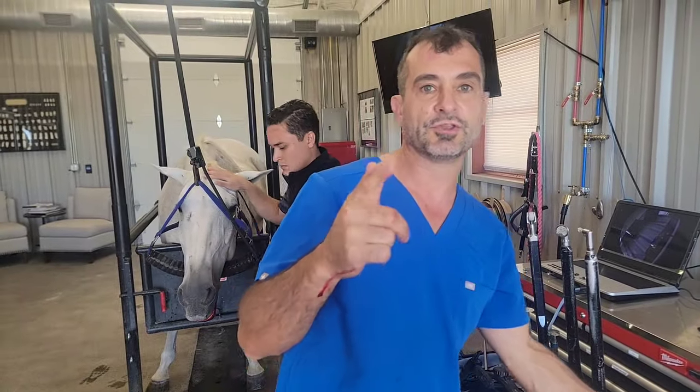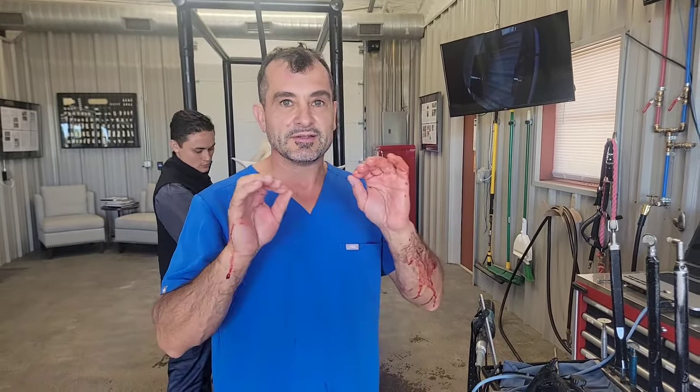So this is a trapped tooth with no clinical crown, and that's how efficient the extraction was. This is the standard of care and this is what we need to aspire to and teach each other. This is faster than a minimally invasive transbuccal approach — it's faster than all other forms.